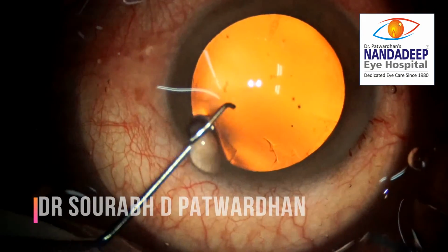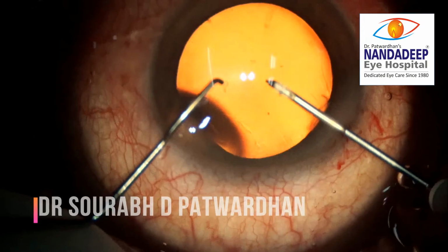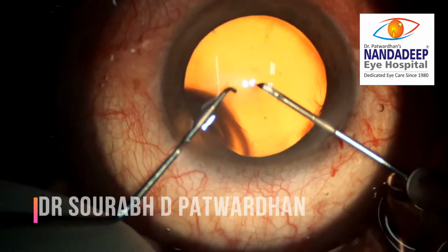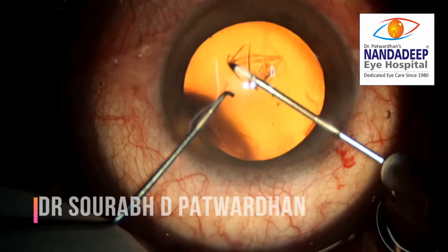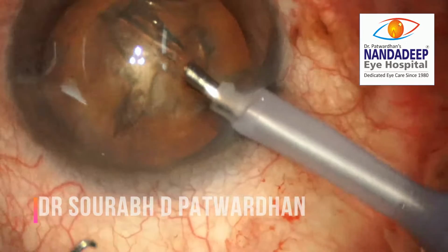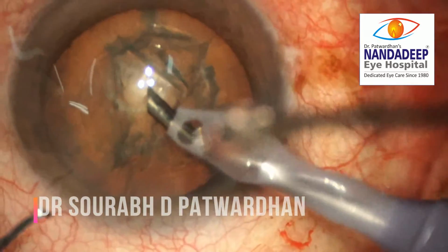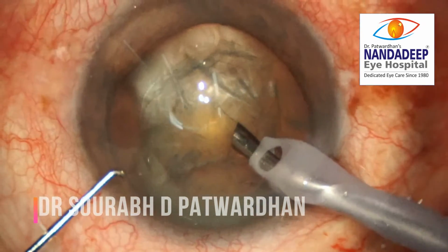Now the major problem with the large incision, which is larger than expected, is that there will be continuous outflow of the fluid during the procedure, which makes the anterior chamber quite unstable. And if you go through the phaco-dynamics, you will understand wound leak is the one thing which even the best of the machines cannot tackle on its own, even having the IOP control mechanism.